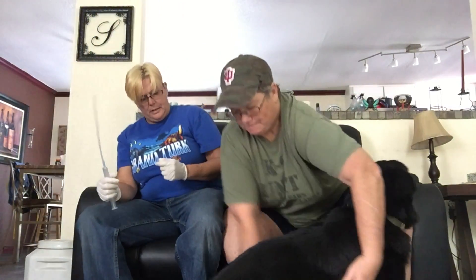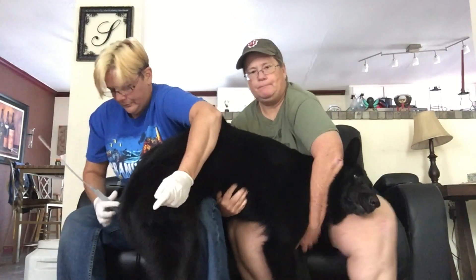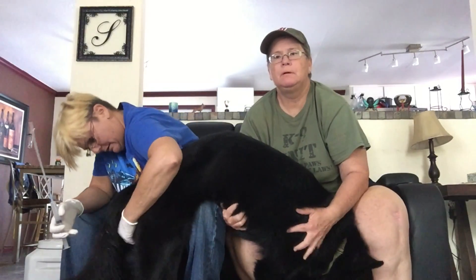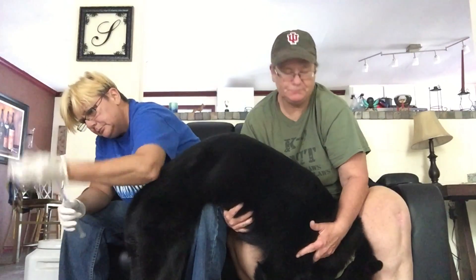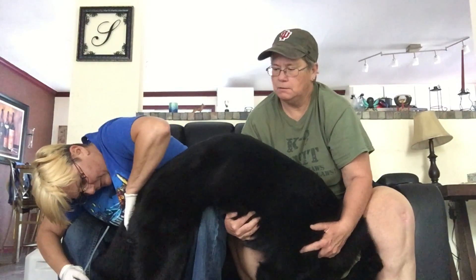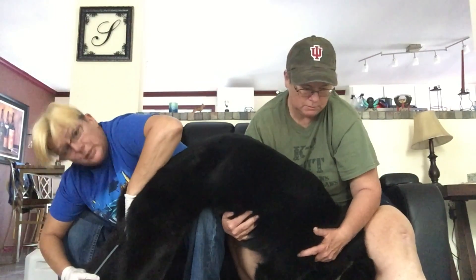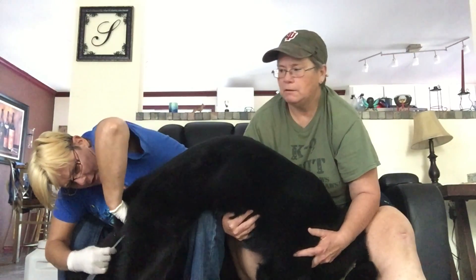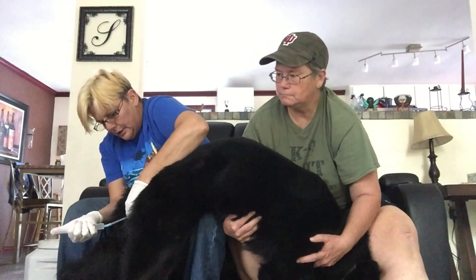Let's raise her up. I'm going to put her on my knee. Let's put her leg down. Find it — make sure you stick your finger in to guide it so you don't hurt her, and also make sure you don't get it in the bladder. Make sure you find it. Roll it in with your finger. That's how I do it to make sure I'm not inside the bladder. She's already pulsating on me.